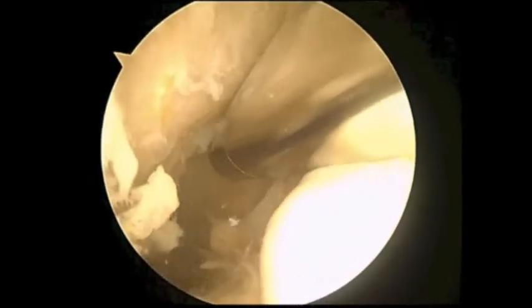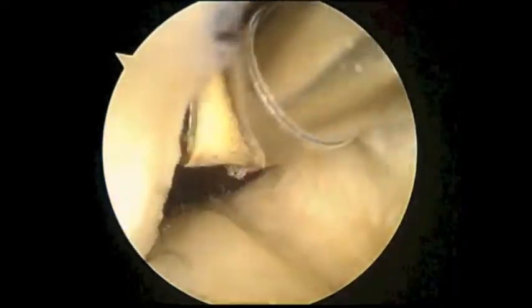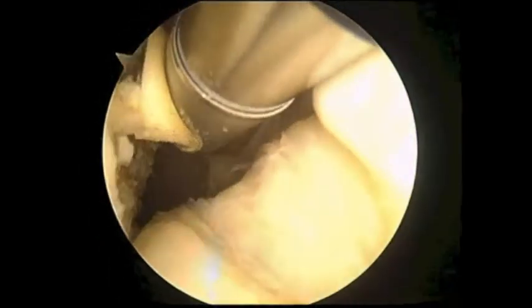We're removing a small ledge of bone that can sometimes block the proper footprint to ensure that we put this ACL in the right position. I want to be careful to remove all the scar tissue and get clean surfaces, as well as removing the remnants of the old ACL, as this can scar and cause a lack of motion in the patient postoperatively if not done completely.